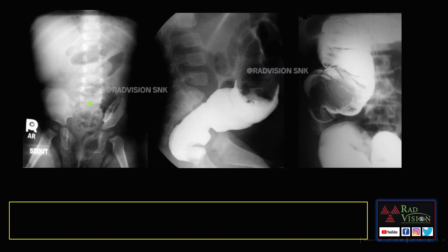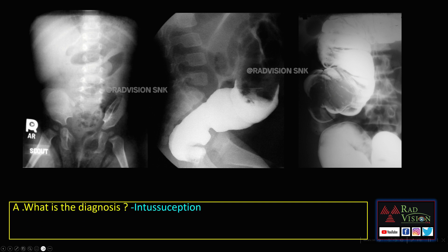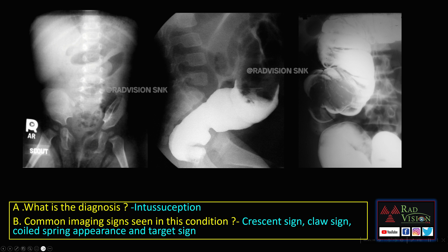Next case: you can see the crescent sign, where there is a meniscus of air surrounding a soft tissue density lesion. There is also the claw sign and the coiled spring sign. By now you know this is a case of intussusception. The common imaging signs are: crescent sign, claw sign, and coiled spring appearance - the protruding intussusceptum with mucosal edema gives a typical filling defect with coiled spring appearance.